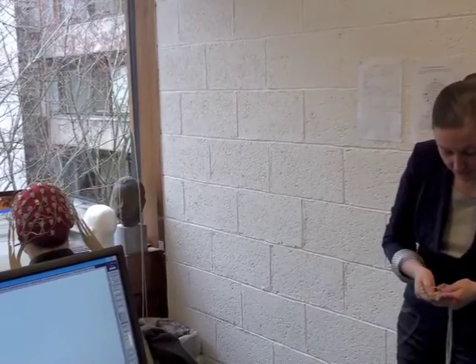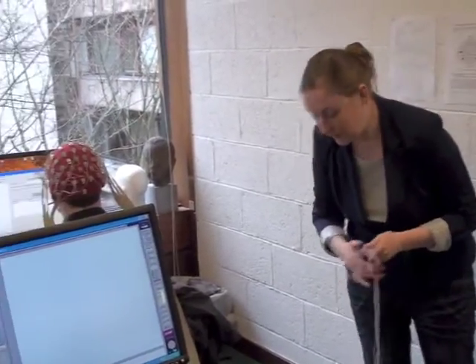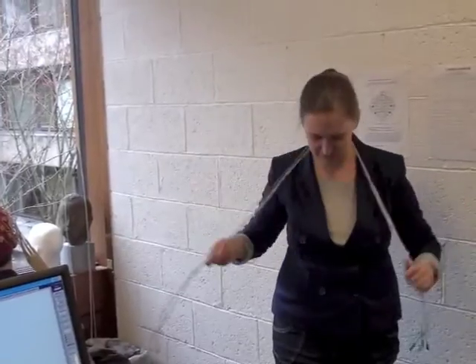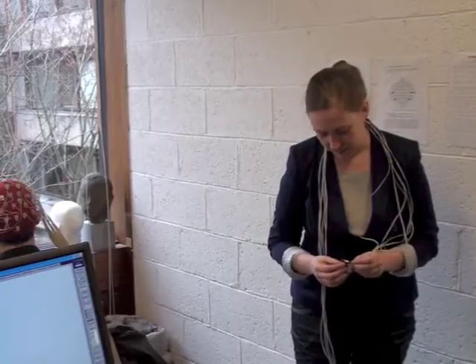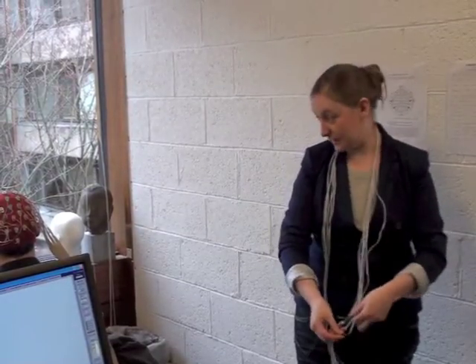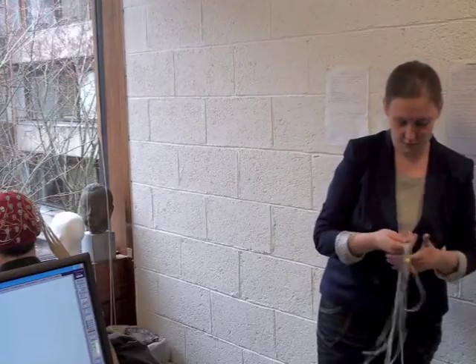Okay, so these are just called EX1, EX2, EX3, all the way up to EX8. I have written down where each one goes. It's kind of important to have that because I haven't found it anywhere on the internet except from being taught it by somebody who trained me. I'm going to start with EX1 and EX2. It follows the same rule as the EEG cap. Everything that's an odd number goes to the left, everything that's an even number goes to the right. So EX1 and EX2.